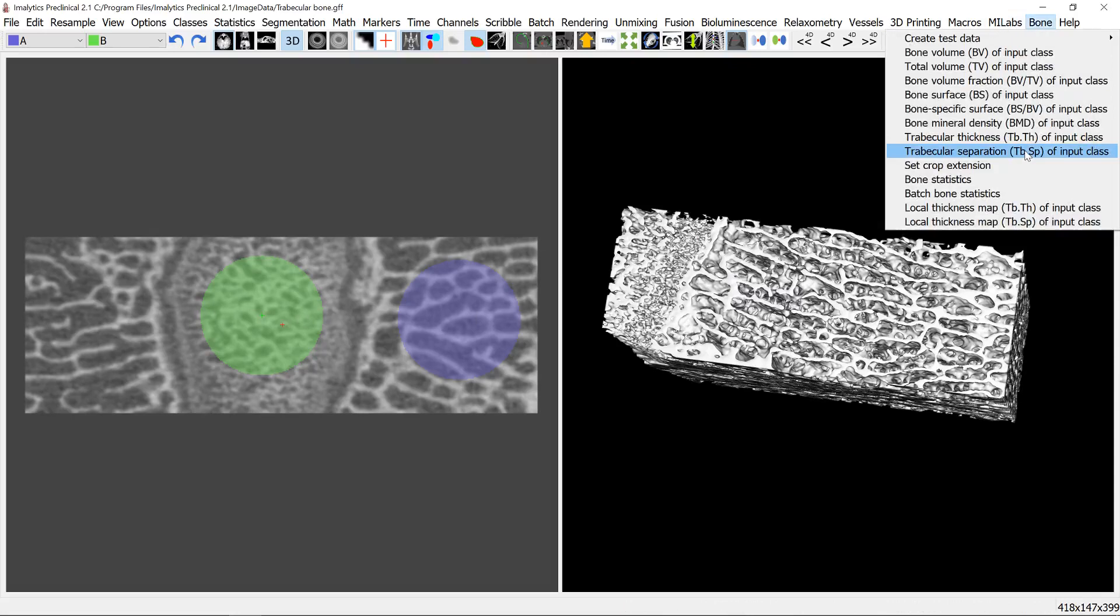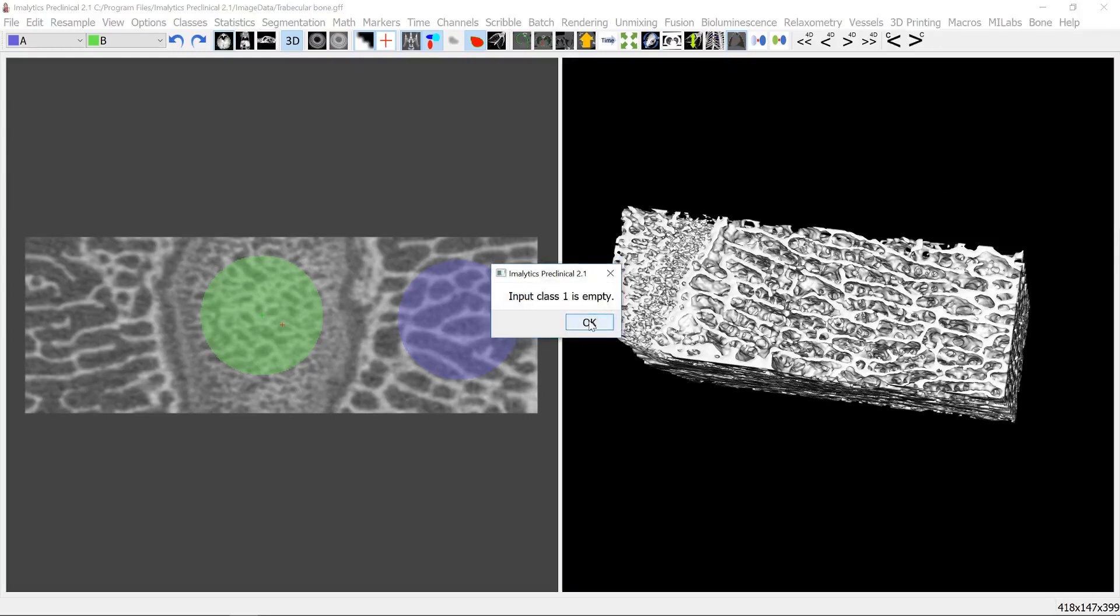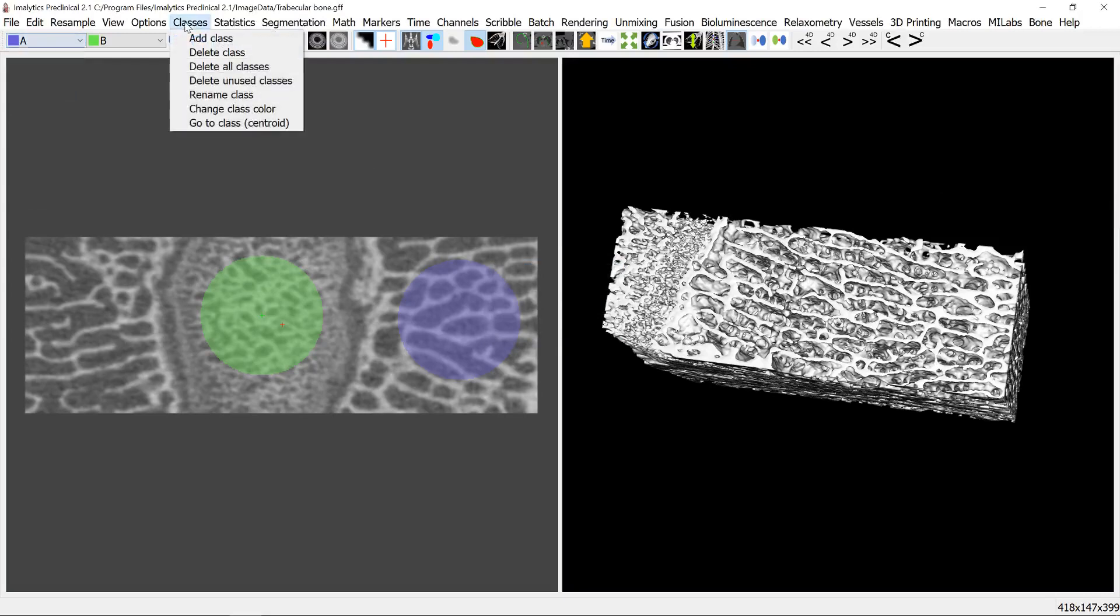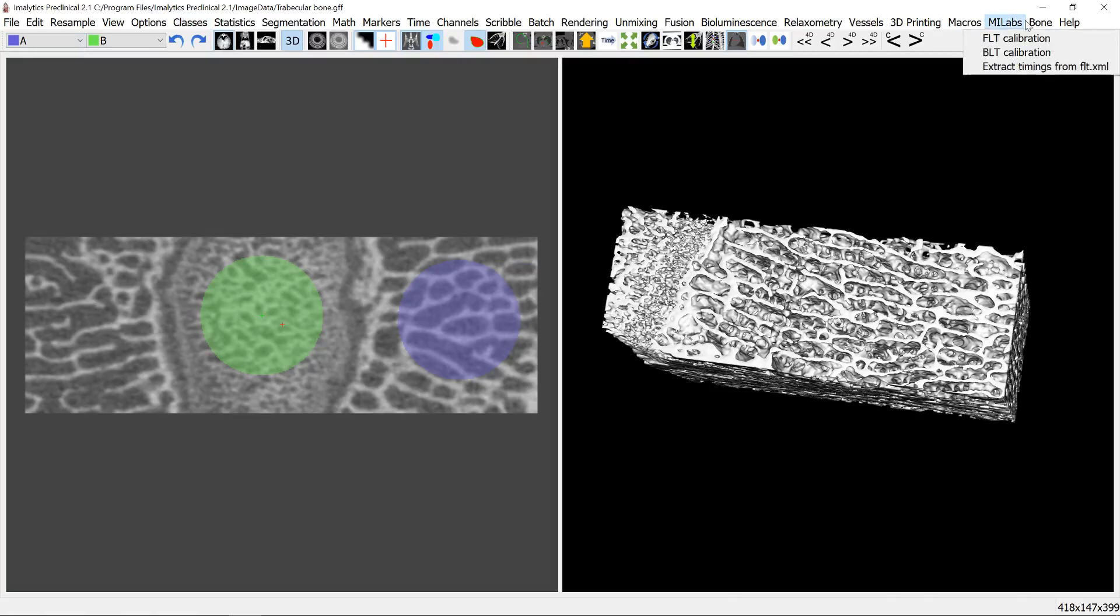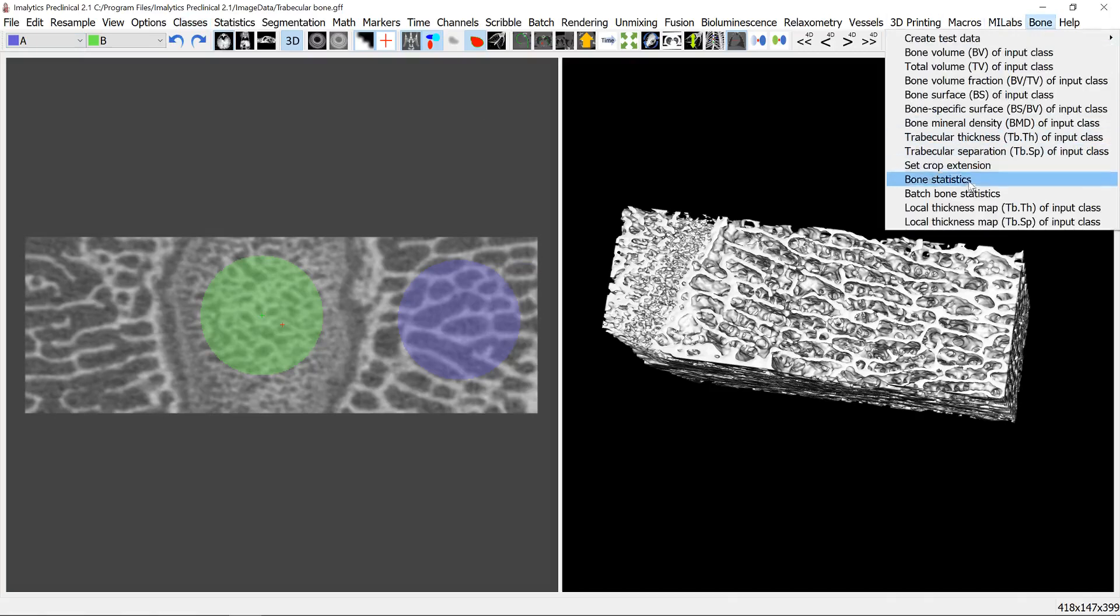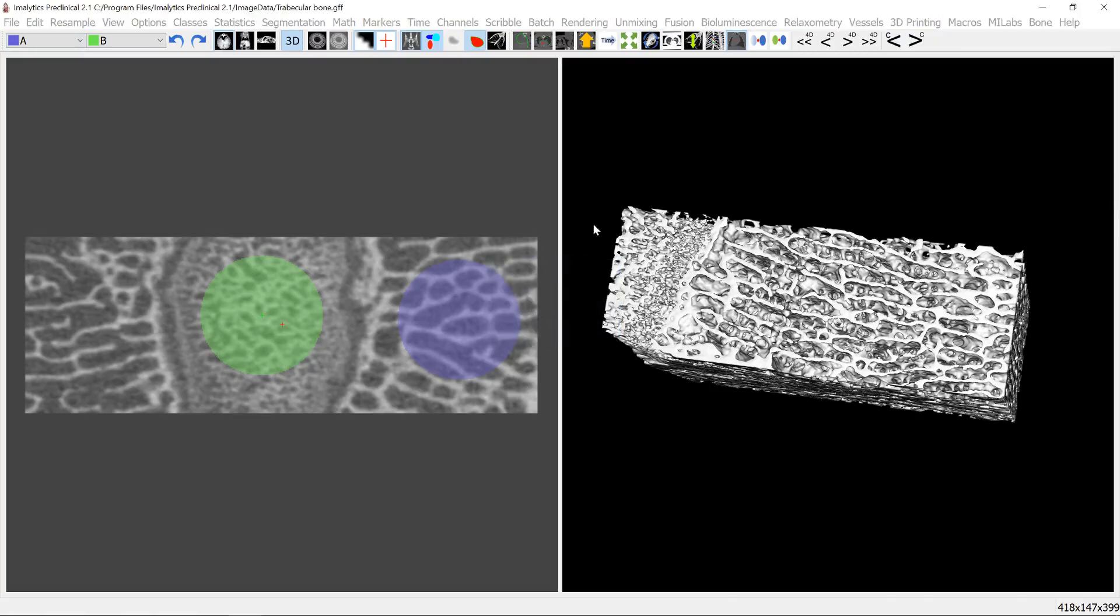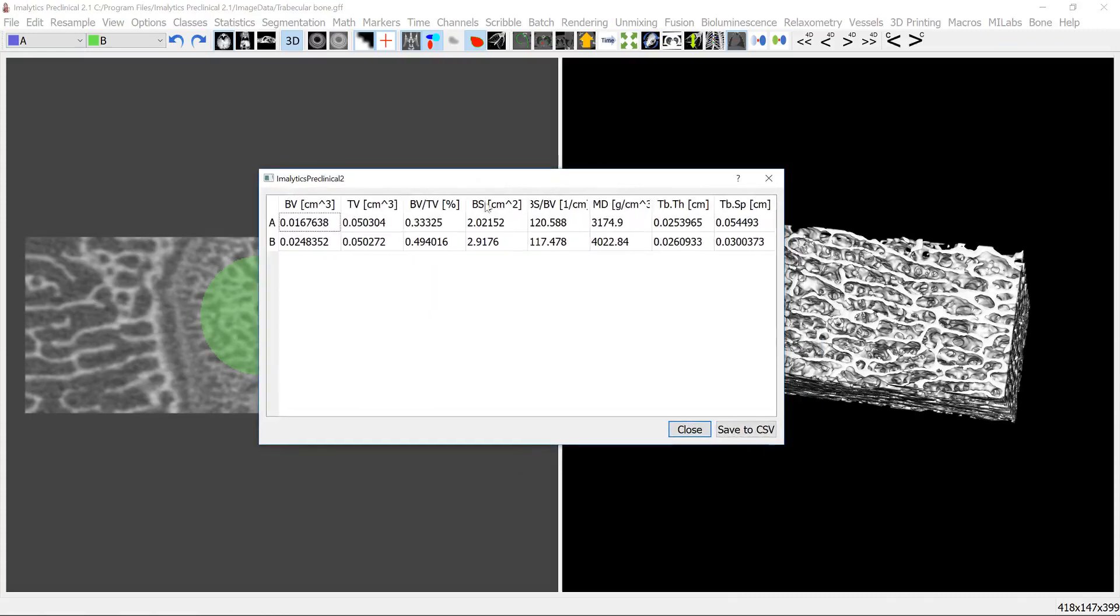Or we can compute it for all classes at once using this menu. We have to remove the unused classes again. Bone statistics, and it's computing it here and it shows here the trabecular thickness and spacing.